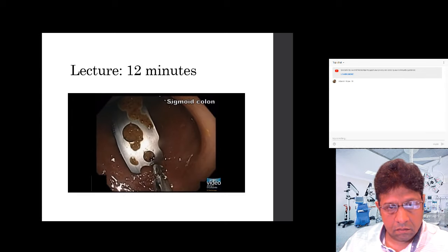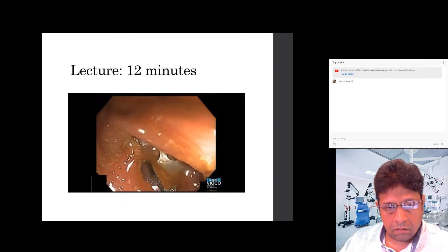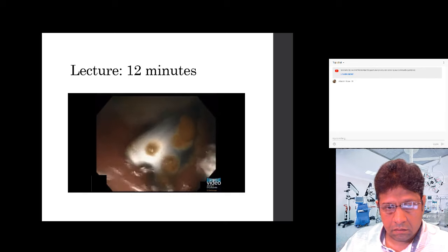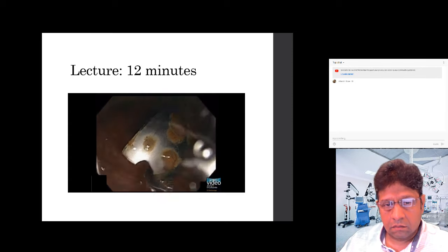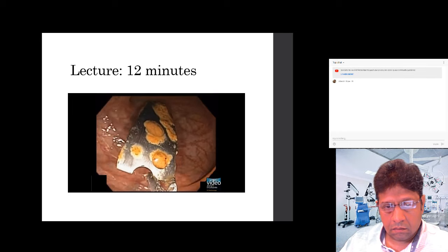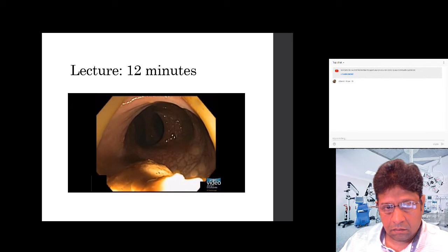In order to avoid injury within the anal canal or the anal sphincter during spontaneous passage of the razor blade, an unprepped sigmoidoscopy is performed. The razor blade is grasped with an endoscopic grasper. The razor blade is then dropped into the rectal vault. An endoscopic foreign body hood protector was placed on the tip of the endoscope. The razor blade is then removed through the deployed endoscopic hood without causing anal canal injury.